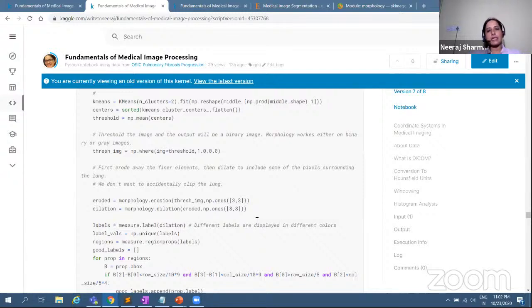So this is just the processing of the images. This whole data set, which we saved at the end as .npz, needs to be fed to the deep learning algorithms, and then we need to work on it. So this is just a half portion of the whole process. That's what I have to present.